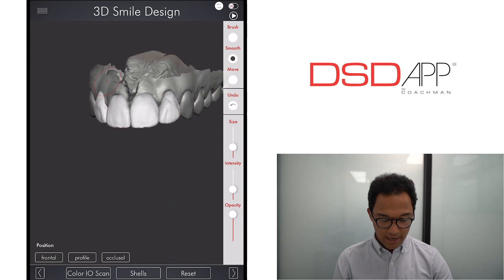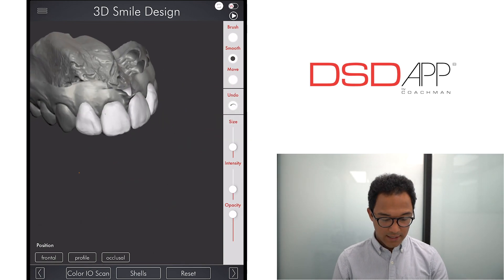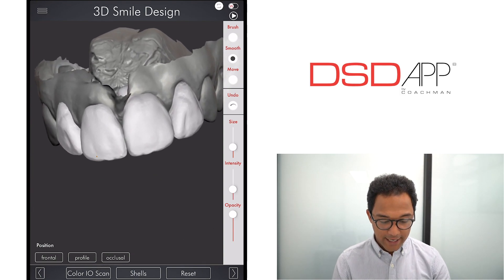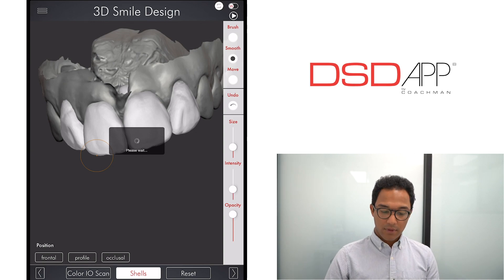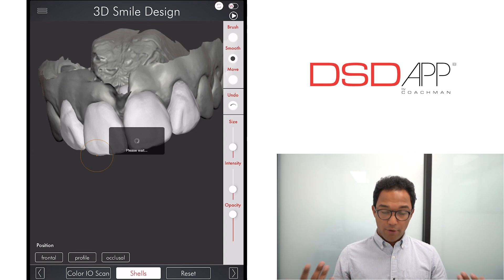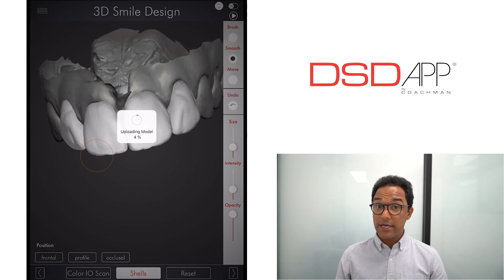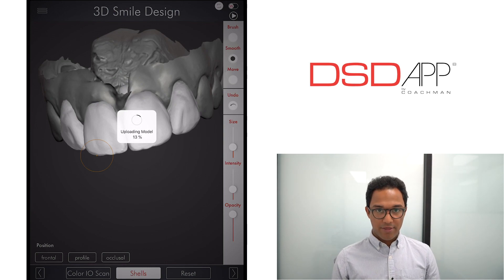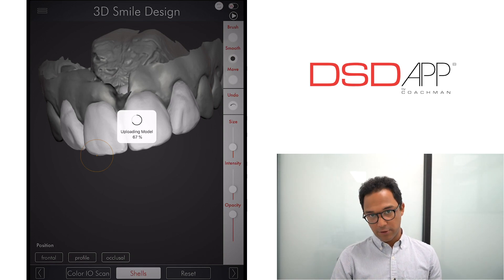And here you have your digital wax-up. From here you can export — you can create an STL file or OBJ file — and with that you're able to print it and then place it into the patient's mouth with a putty and a bisacryl.